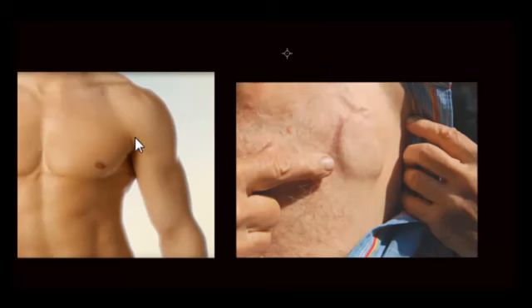As I mentioned to you earlier, the pacemaker insertion is performed under sterile conditions in the cardiac catheterization lab or sometimes in the operating room. Usually the left or the right shoulder is cleaned with antiseptic solution and sterile drapes are applied over the shoulder area. The area right below the clavicle is exposed, where a small incision is made just below the clavicle, measuring about 2 inches, and through this incision a needle is inserted into the vein, and once the vein is secured, a guide wire is passed into the vein, and through the guide wire a sheath is introduced.